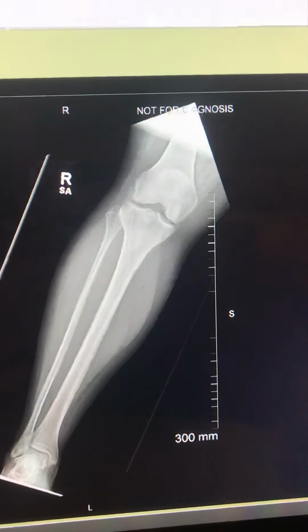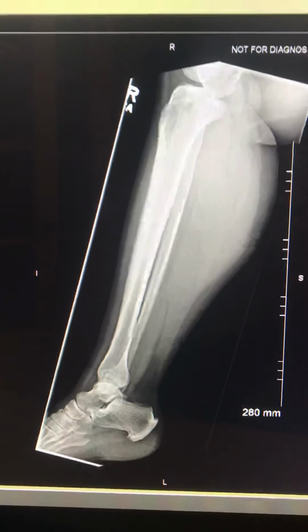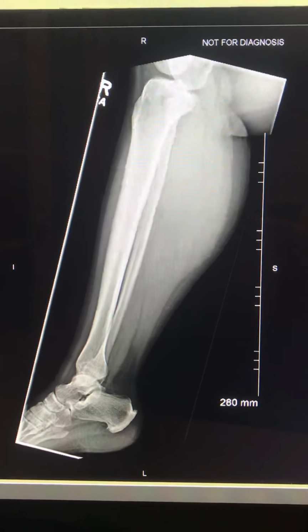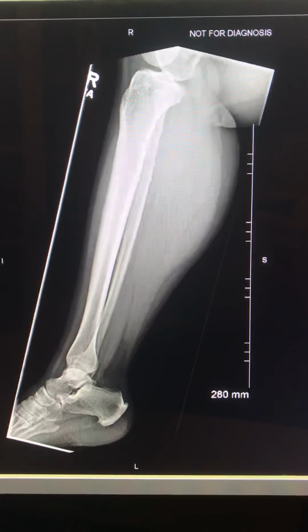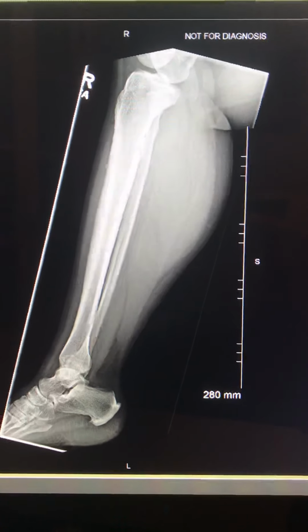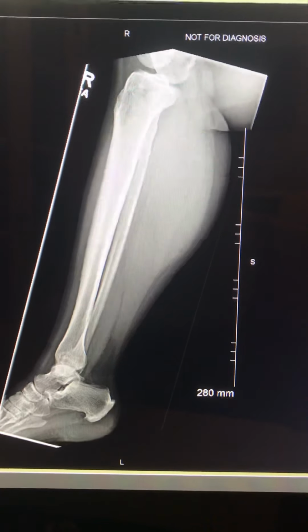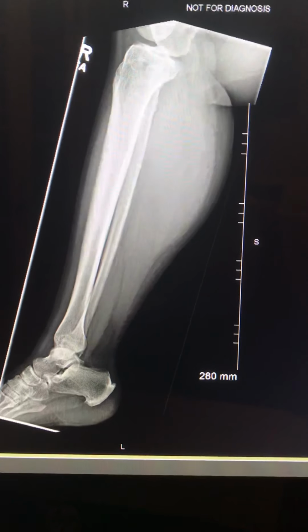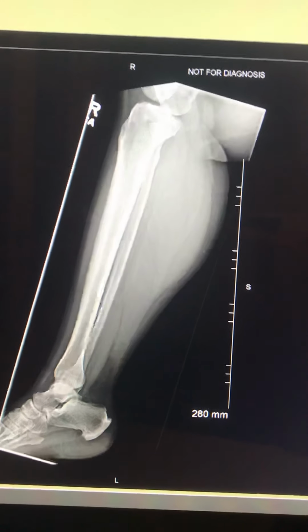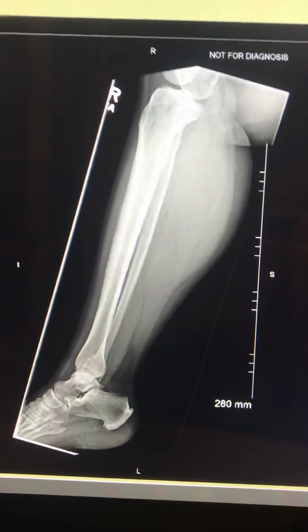Moving on to the lateral. This is the lateral. The patient was able to bend her knee and rotate the entire leg laterally. A few towels were used to prop her knee up for the exam. The central ray was positioned to the mid-tibia fibula, collimated on both sides and from top to bottom to include proximal and distal tibiofibular joint space. The patient was in a lot of pain but was able to move slowly into the positions.